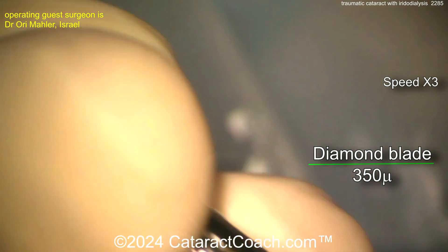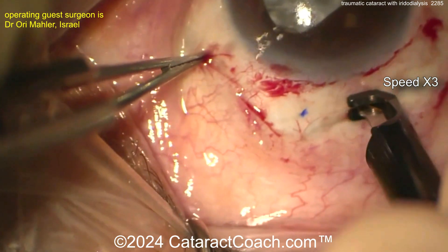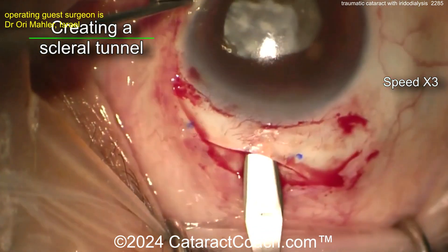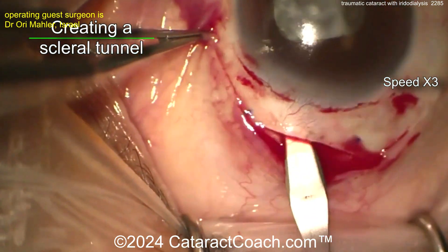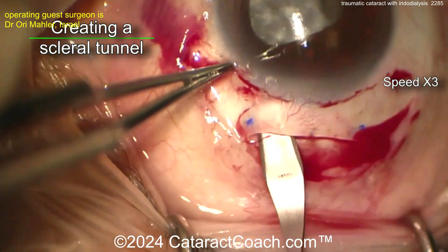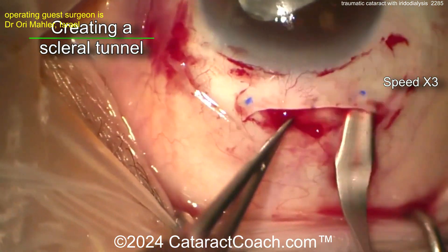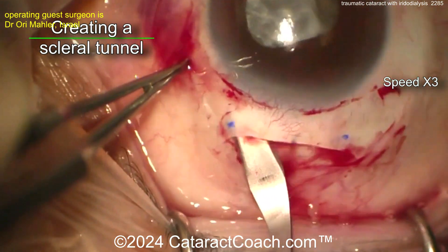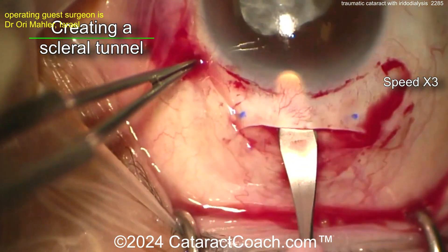Marking off here — 350 micron diamond depth — and making basically a half scleral depth groove from one side to the other. Scleral tunnel, so maybe doing MSICS here. Creating a nice scleral tunnel with good tunnel length. In a case like this, you want to see how much zonulopathy there is — are you going to do an intracapsular, or is there enough capsular support for extracapsular removal? Looks like an MSICS kind of incision.